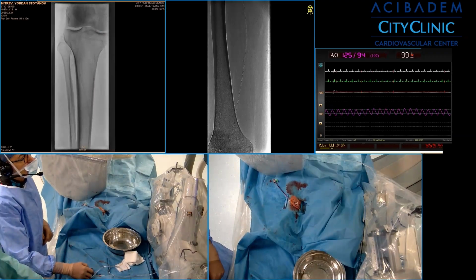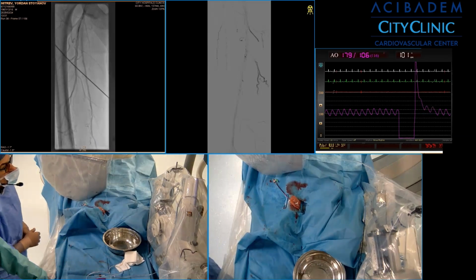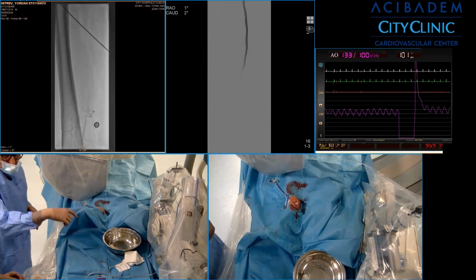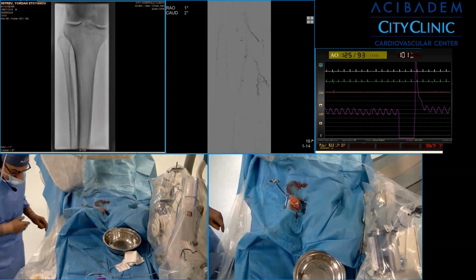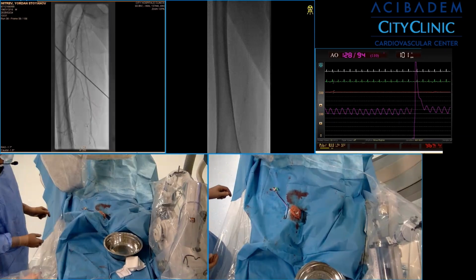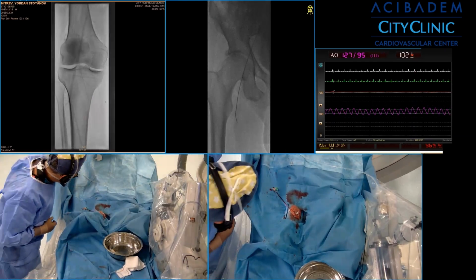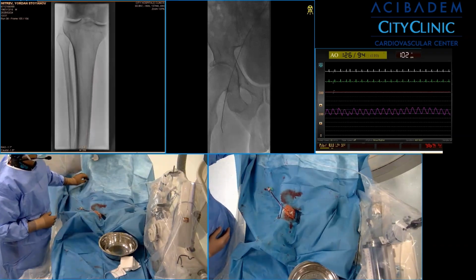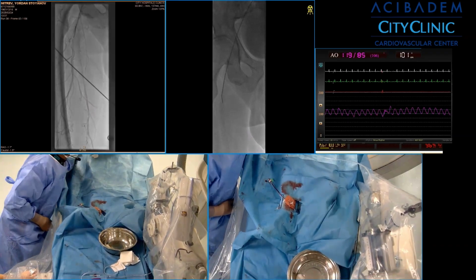I think it's not bad. Let's make one follow up, and let's prepare the DCB, because hopefully you will agree that the result is quite not bad. Quite excellent. And yes, we can proceed with the DCB.